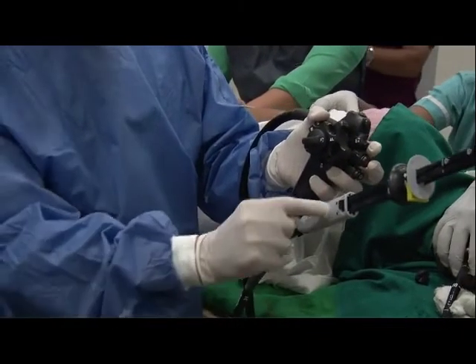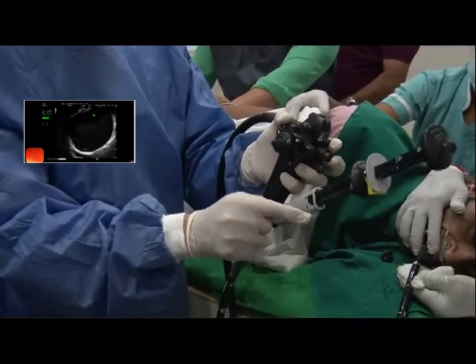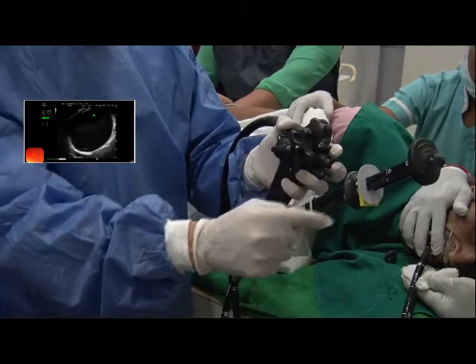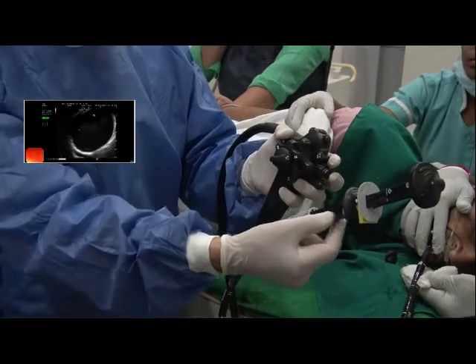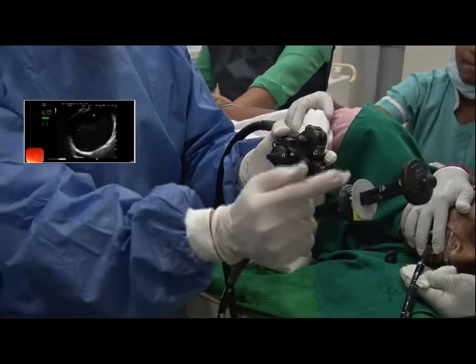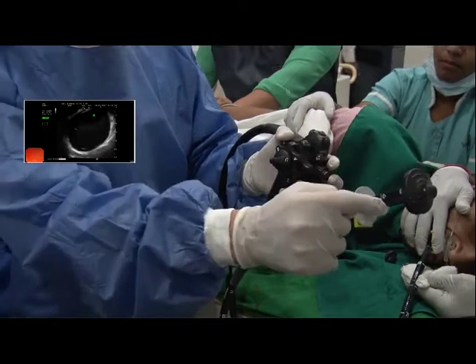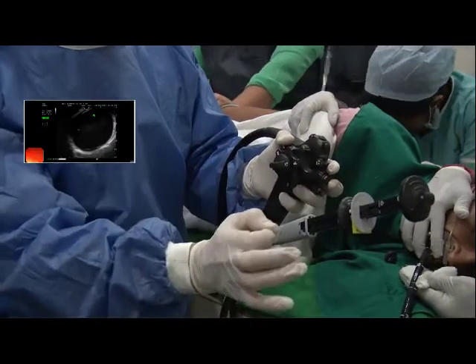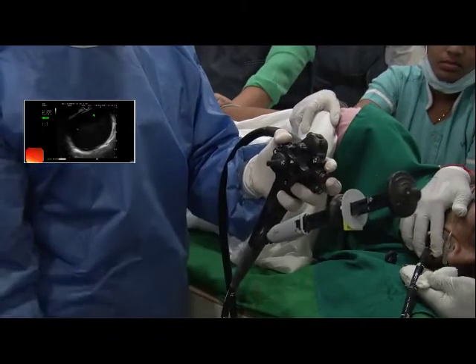You can change the orientation towards the operator. There's a lock and unlock button here — we unlock it to advance the black hub, which advances the sheath forward, just like an FNA needle advancing the needle forward. Then this gray hub is what releases the stent. We release the distal flange and the proximal flange completely independent of one another, with a full stop between. As we pull the gray hub back, it will click when the distal flange is deployed.